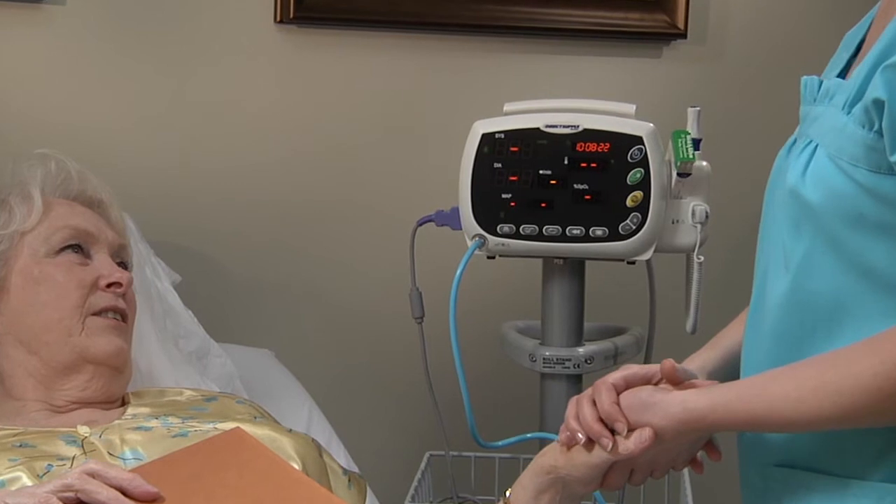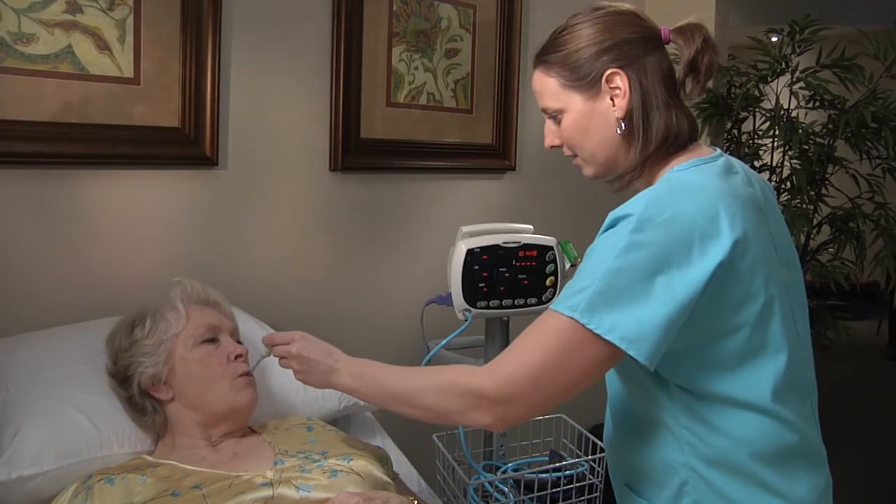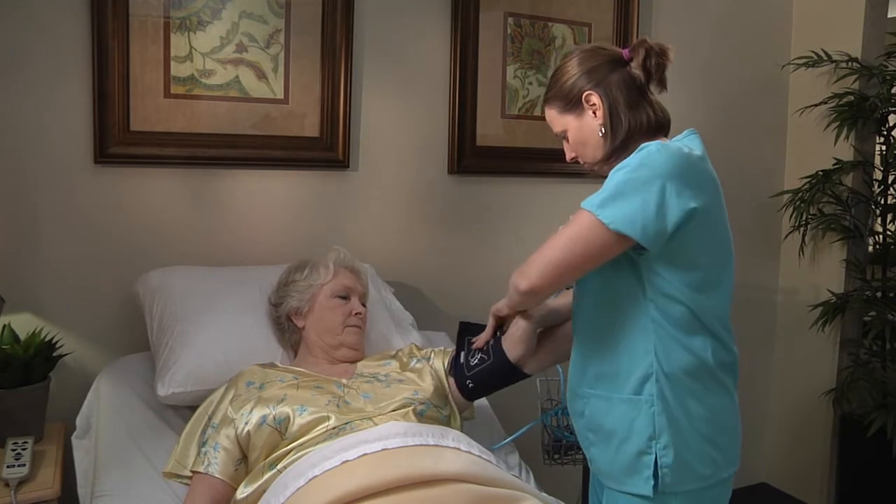The Attendant Vital Signs Monitor is an all-in-one quick solution for obtaining continuous or spot check vital signs. It measures temperature, pulse oximetry, blood pressure, and heart rate.